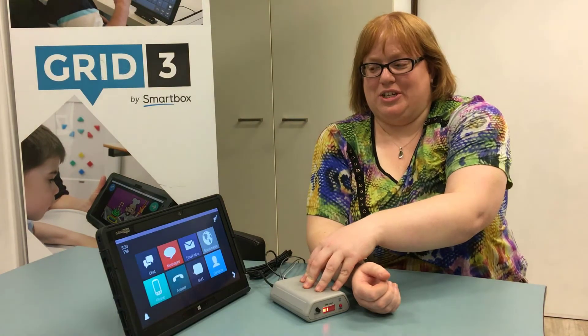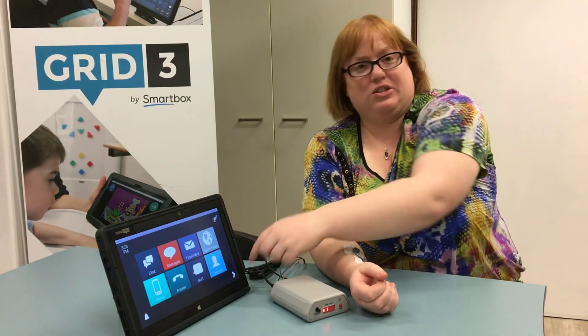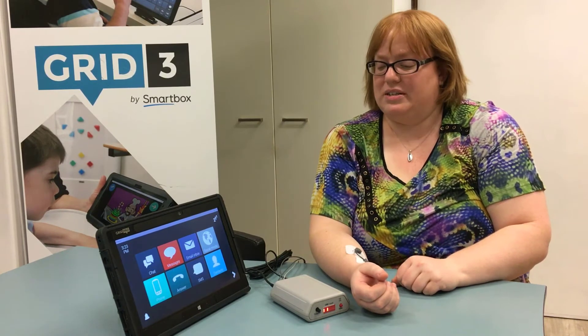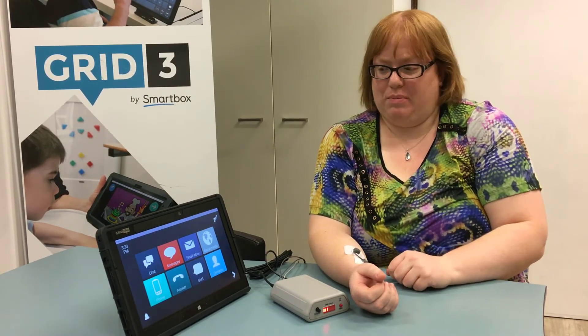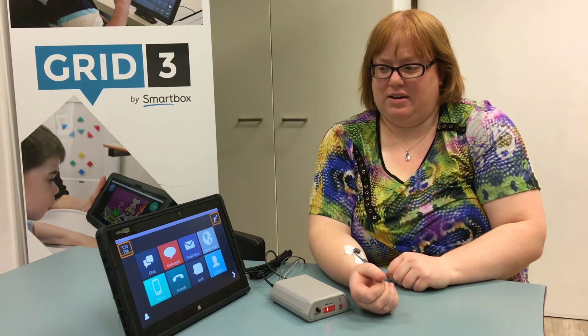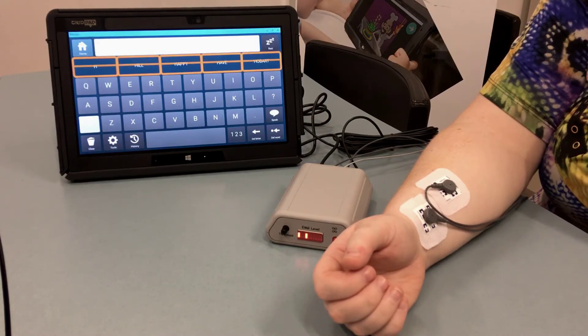This is our new Tinkintron EMG switch. It's currently connected up to one of our Grid Pad Pros. It's just like any other switch — it hooks into the switch jacks. This one picks up muscle movement, so if I move my fingers it starts the scan, and I can go into anything the same as I would with another switch into the Grid 3.